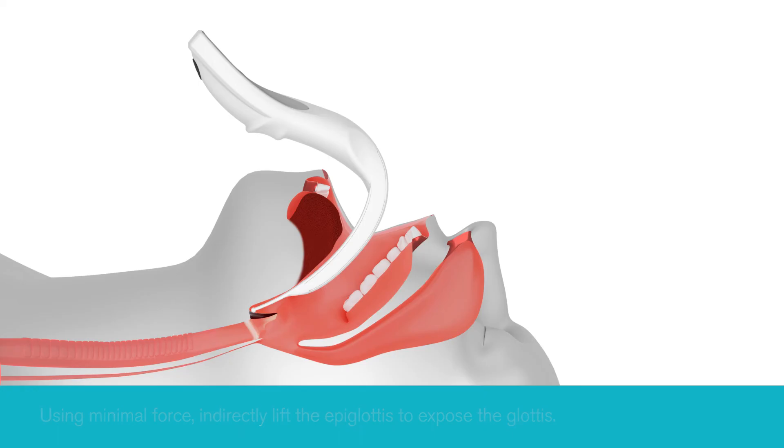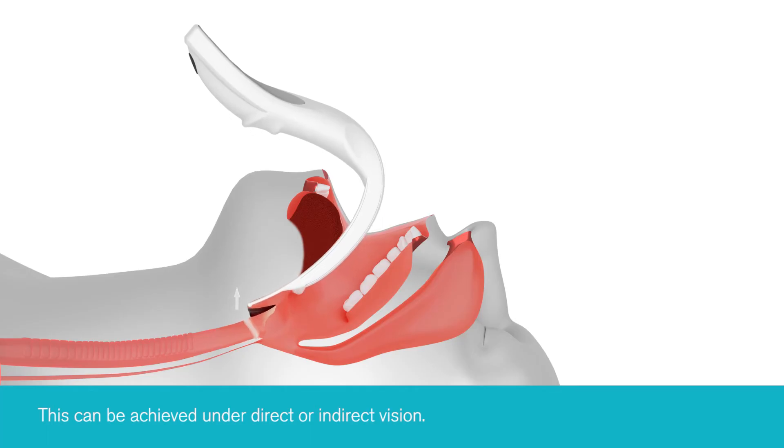This can be achieved using a direct or indirect view. If deemed necessary, bimanual laryngoscopy and/or head elevation can be used to improve the view.